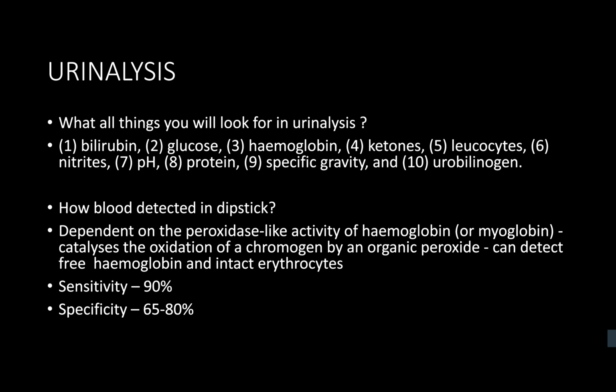Okay, regarding the urine dipstick, what is the principle, how does it work? So this works on the principle that the urine dipstick strip, each square, contains a chemical reagent, which then induces a color change when it comes into contact with the urine. These are through chemical reactions.